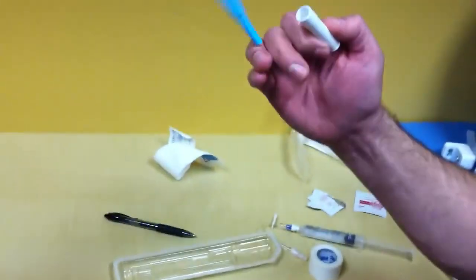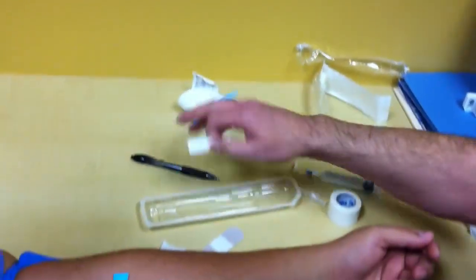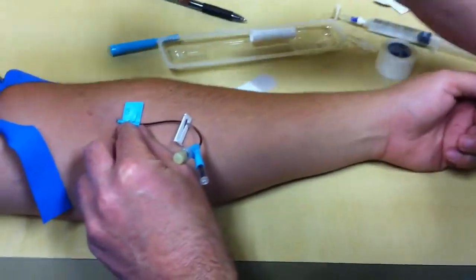Now the needle is trapped inside of this case — perfectly safe. It still needs to go into the sharps container.